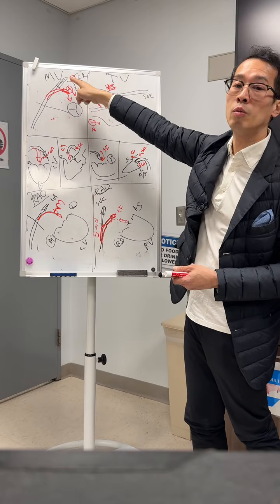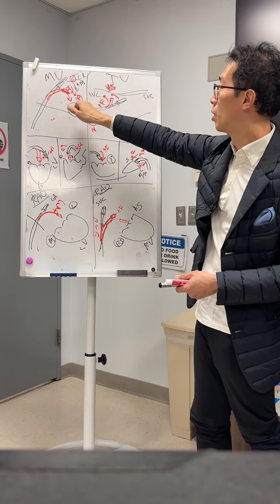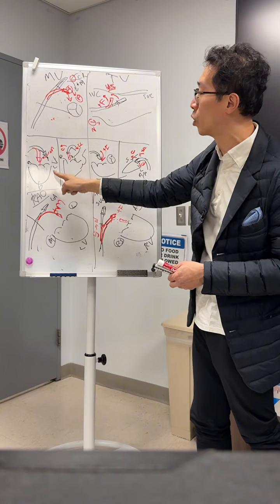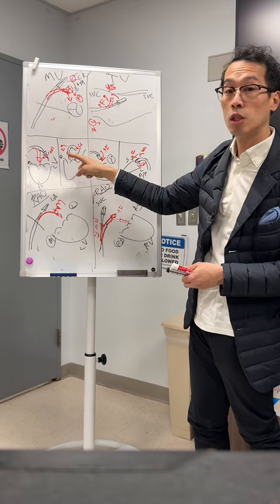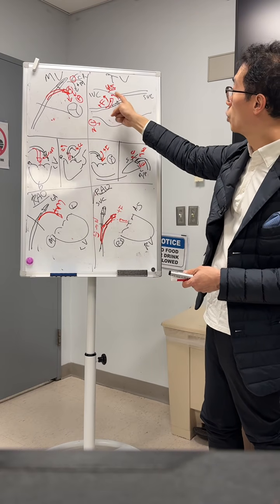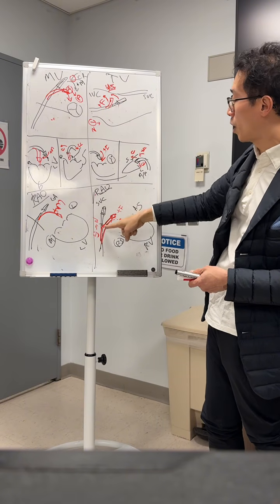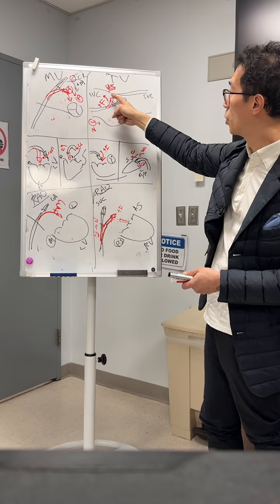Make sure you don't hit the Coumadin ridge. You ask them to show it to you, and as you M down, okay, and you do posterior guide torque to get into view, you ask them to show you this view so you know how lateral medial you are and how anterior posterior you are. And same thing with the tricuspid, as you flex down, okay, and then also you get rid of your negative to neutral. You want to be able to do that.